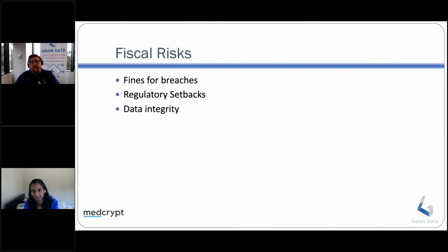There's a lot there that you have to make sure, hey, can I actually depend on this data for doing anything meaningful? Does it really represent someone's blood pressure? Is this really it, or has someone gone in and rewritten the database, and now someone whose blood pressure is 200 over 120 and is about to die, it's reporting they're at 90 over 60 and they're just fine. That's an extreme example, but it's still a valid concern.